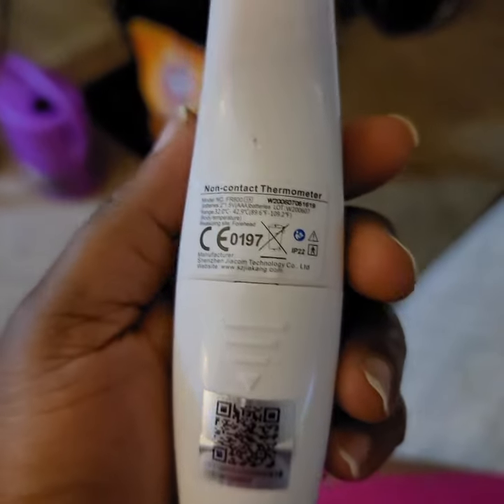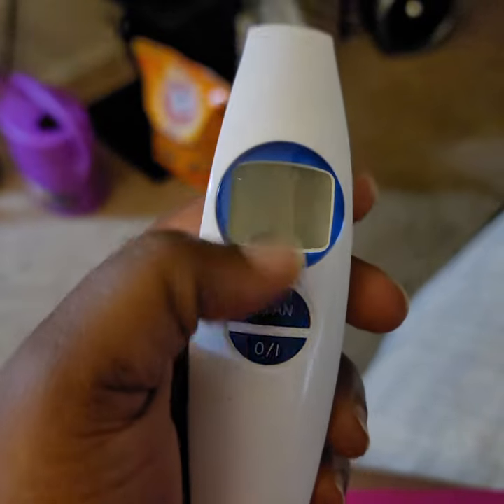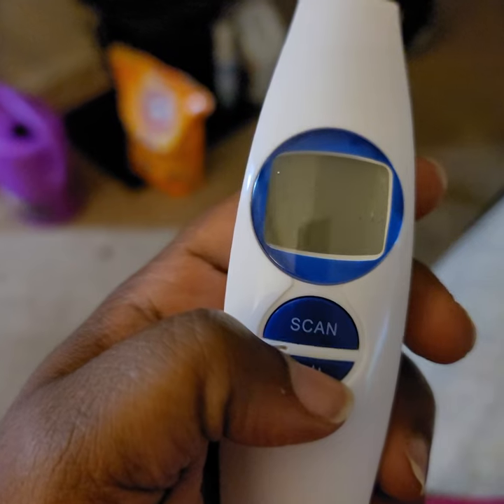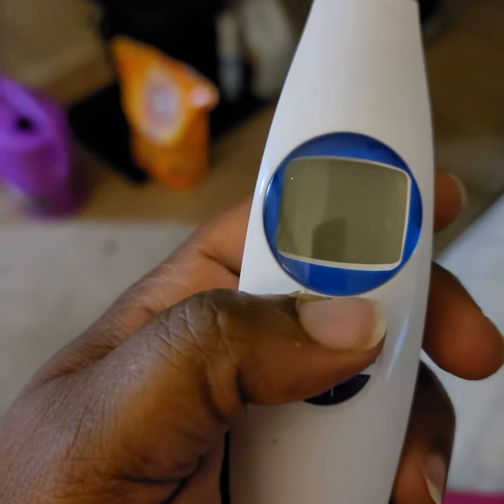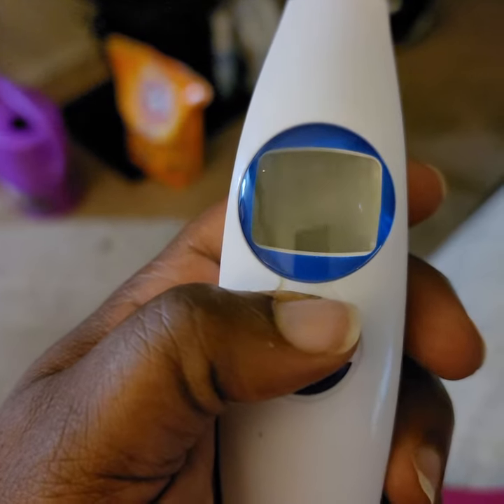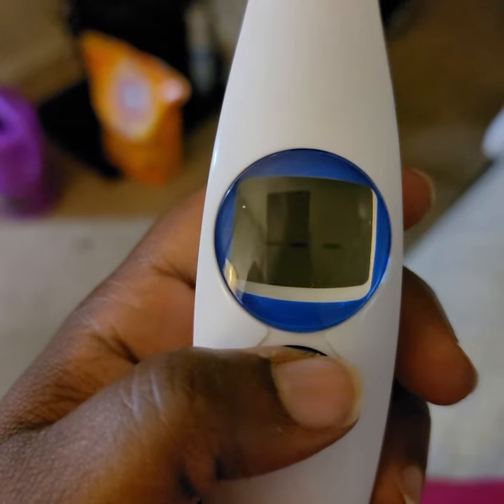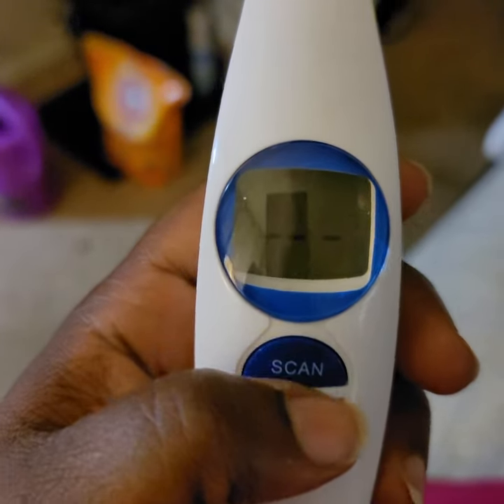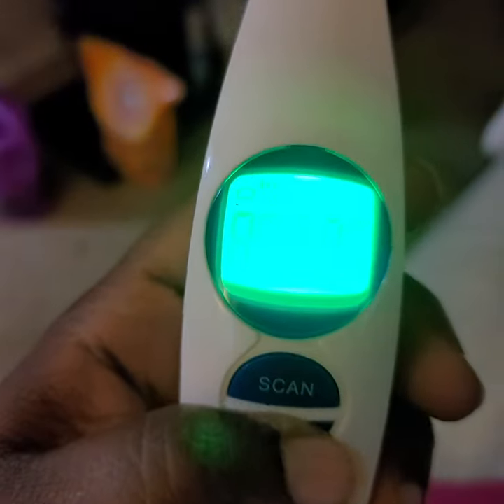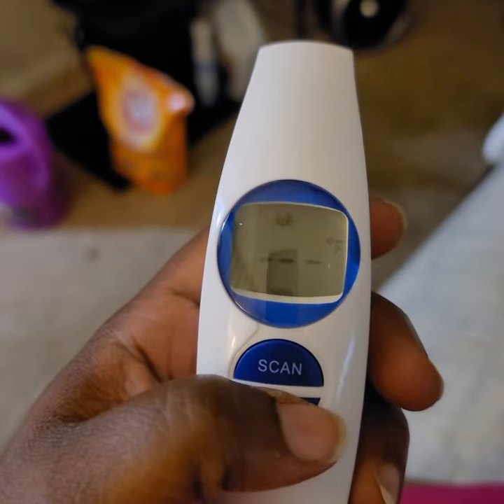I have this non-contact thermometer and it got stuck on Celsius. This is how you get it off Celsius: you hit the scan button, you hold it, you see Fahrenheit and Celsius. Press it again — Fahrenheit. Press the power button, scan. Oh, that didn't work out, but it's on Fahrenheit now.